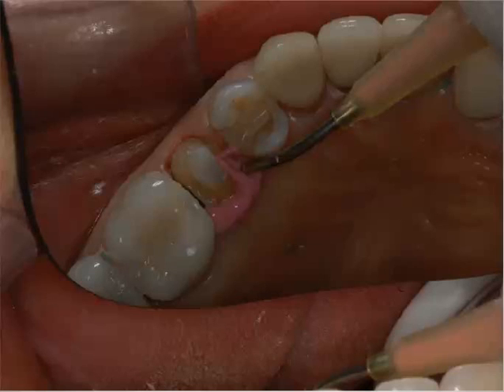We're going to start in one fluid motion, inject this into that open crevicular area, and follow that around in one smooth motion, one unified bolus of material. That's the most critical time to get that in the sulcus, when that tissue is at maximum distension. Because after about 30 seconds or so, the elastin fibrils, which you have distended through the compression of that cord, will start to relapse and start to collapse. So we want to get our material into that sulcus first to support it as it goes through that collapse process.